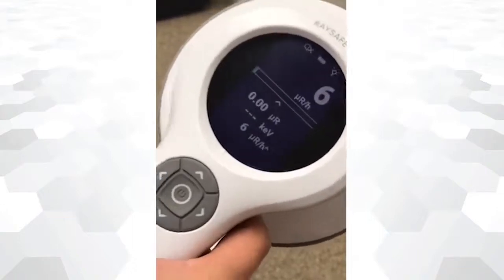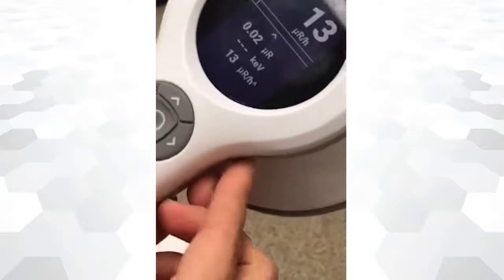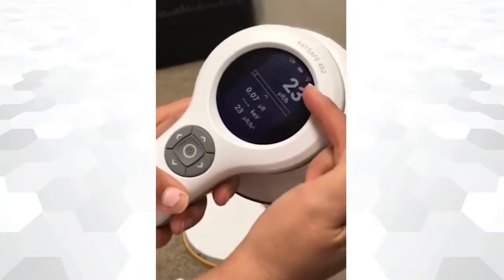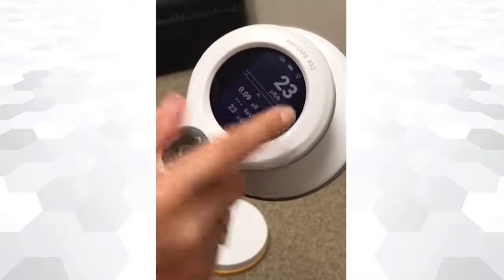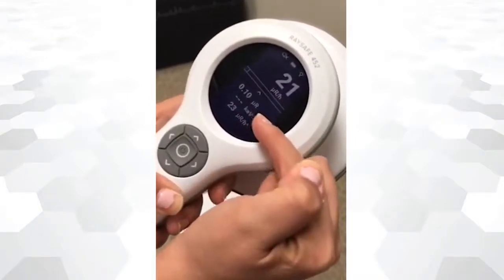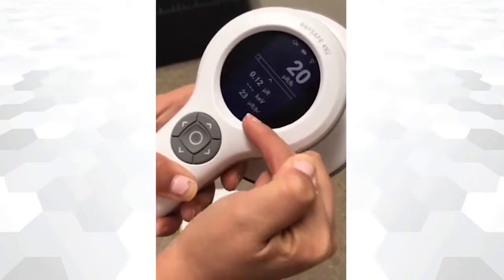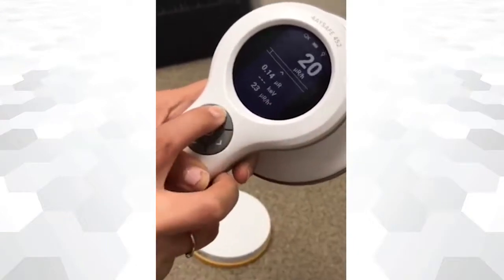The main screen is composed of several sections. At the top, you will see the current audio and light setup and battery life. The remaining screen is composed of several rows: the first row represents the radiation intensity, the second row the accumulated dose, the third row the radiation mean energy, and the fourth row is the highest intensity recorded.